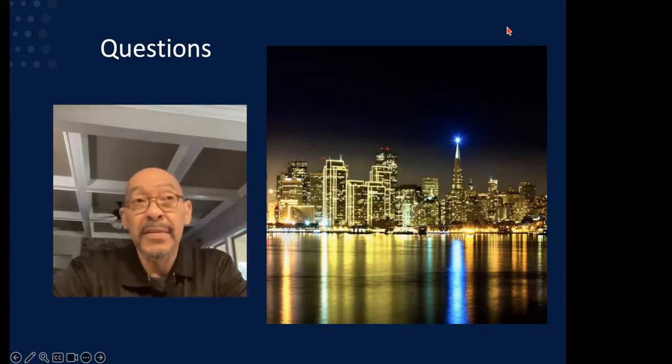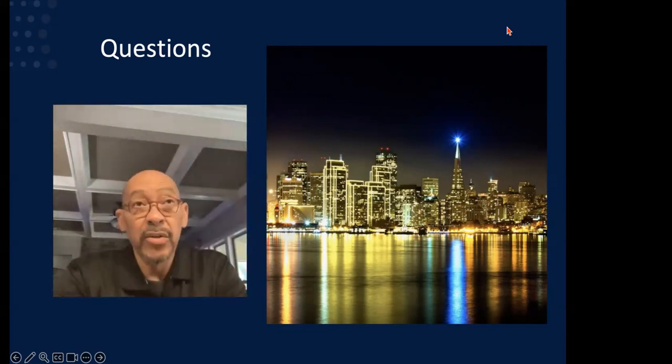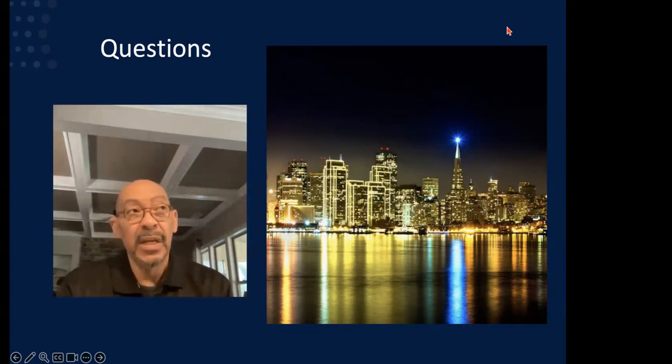The lens that we have designed will go from a high energy to low energy, or accommodative, disaccommodative to accommodative state in less than a second. So it's really, really, really fast. And that's what we have measured on the bench. We will actually do those measurements in our clinical study. And as I mentioned in the early part of the presentation, we consider that a safety issue.